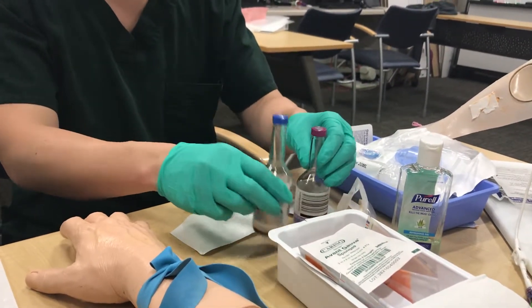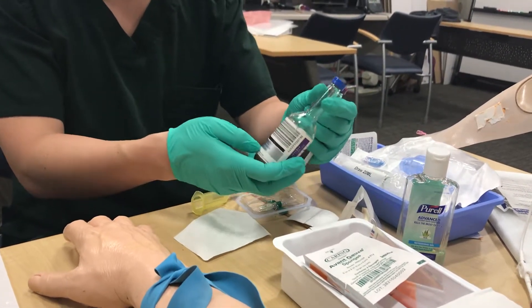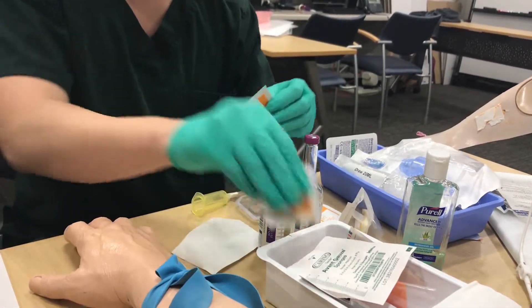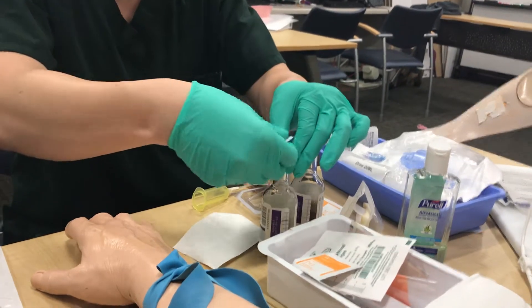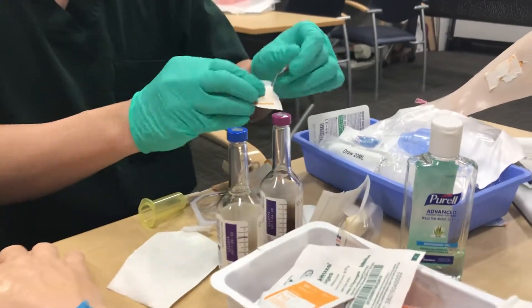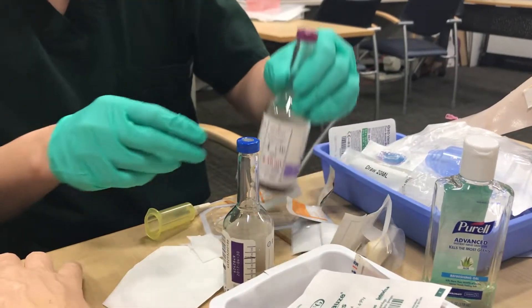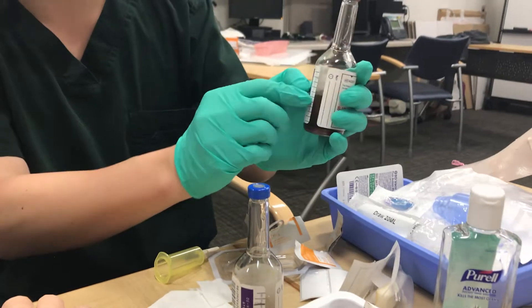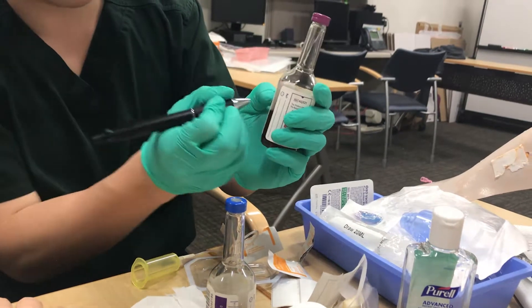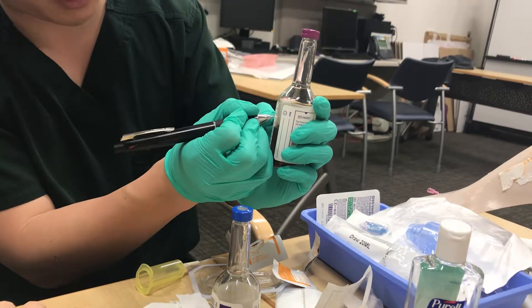Grab your bottles and make sure you know which one is aerobic and which is anaerobic. The blue one is aerobic, so you do that first, and anaerobic second. Clean the tops of the bottles — scrub for 10 to 15 seconds — and don't leave the alcohol pads sitting on them. Then use a pen to mark where your 10 cc level would be on the bottle.